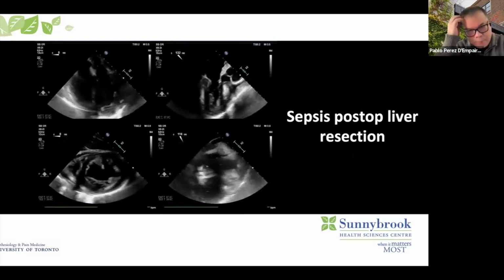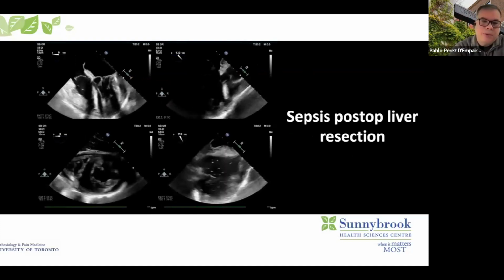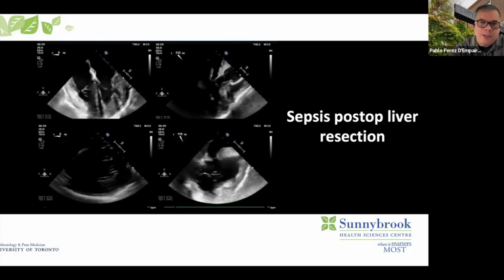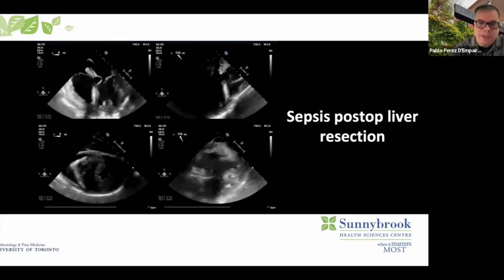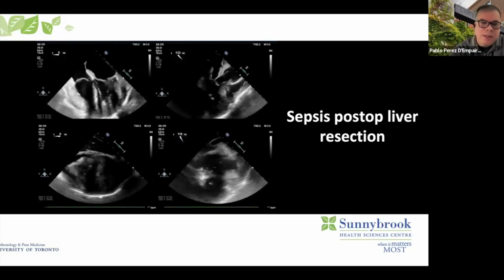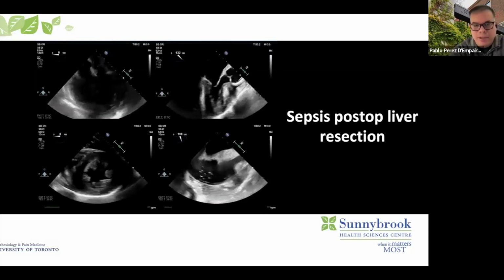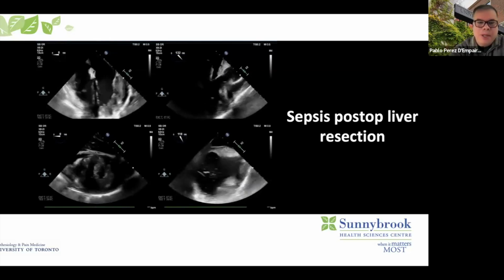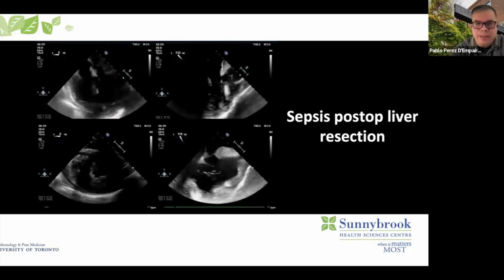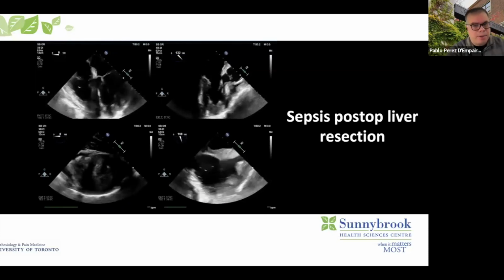And this is a very compelling and humbling case, because the patient was in the unit after a complicated course of hepatectomy for cancer that didn't go well in the initial post-op days, had some bleeding, and eventually got into a septic shock and went into the ICU to become reintubated and being treated for sepsis. And at some point, they decided to take this patient to the operating room for a further washout. And I was the anesthesiologist.